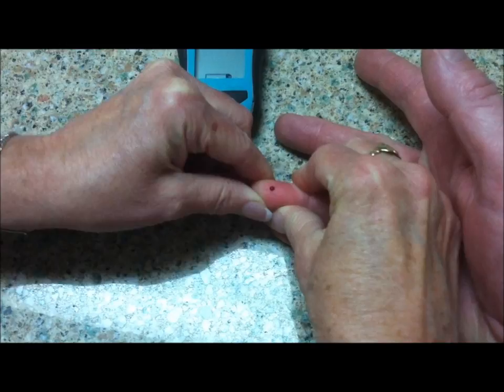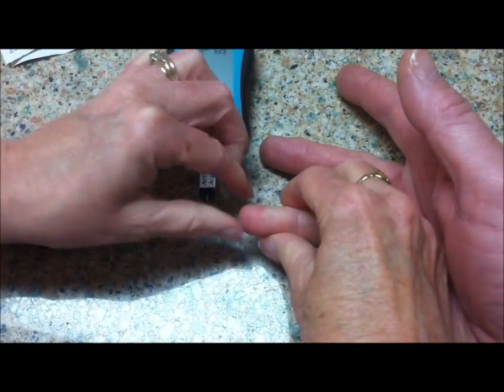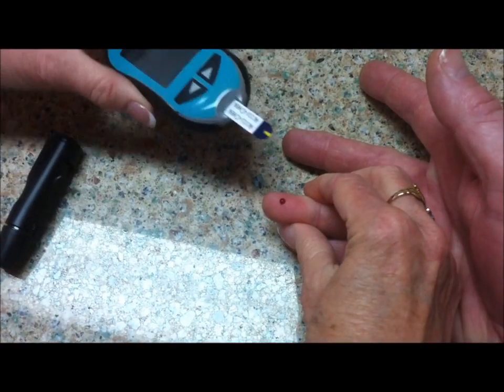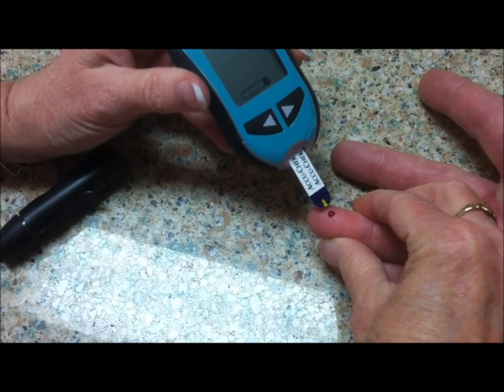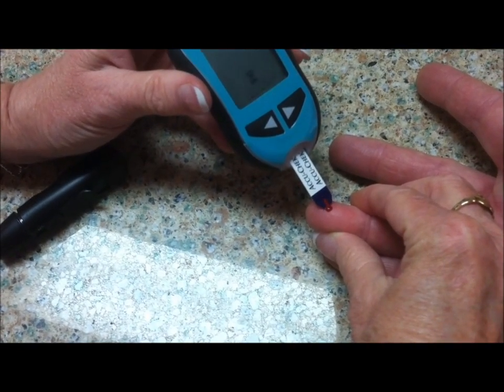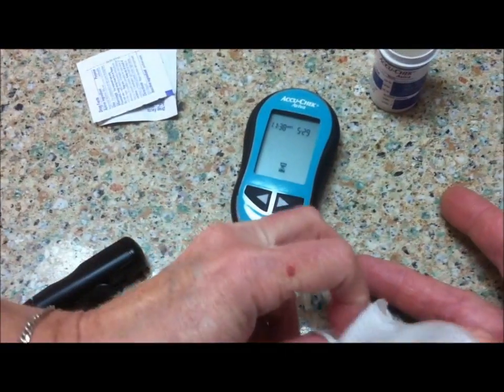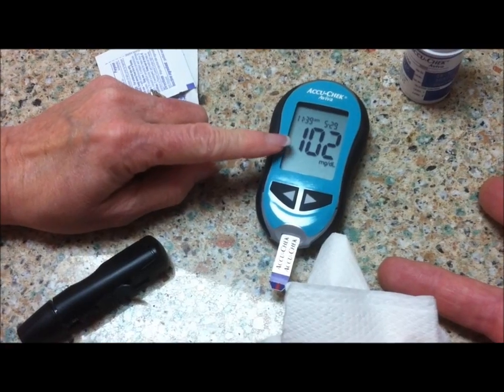It won't be as uncomfortable for the patient. We're going to squeeze a little bit. We're going to wipe the first drop of blood away, only because that could have been mixed with a little bit of the alcohol. We take the drop to the test strip — there's a little suction that pulls the blood to the strip, and the result is 102.